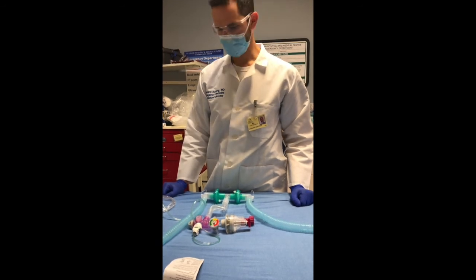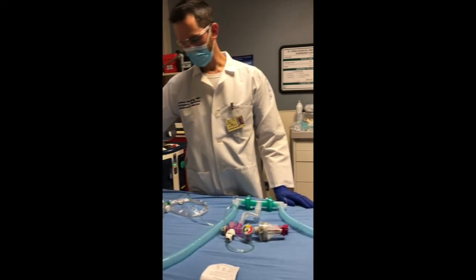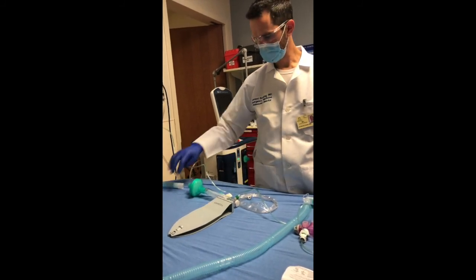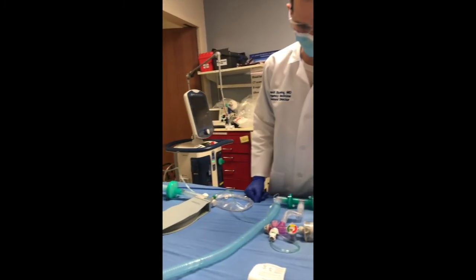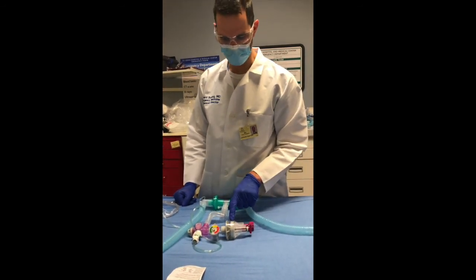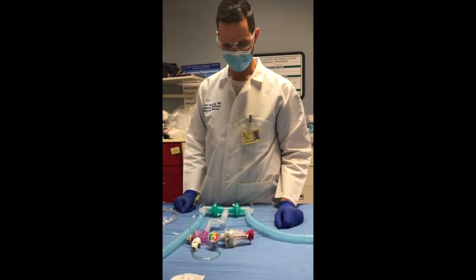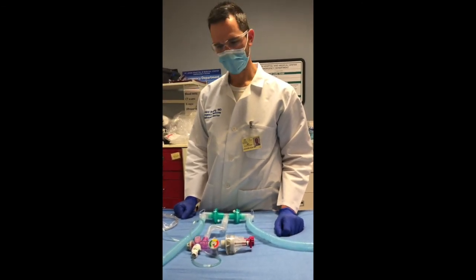If for some reason the system stops ventilating, the most common cause is a connector that has popped off. If that happens, reconnect it. If it's still not ventilating, it may be that the diaphragm is stuck — check whether or not the diaphragm is moving. If that is the case, then the Vortran has to be replaced. Thank you very much.